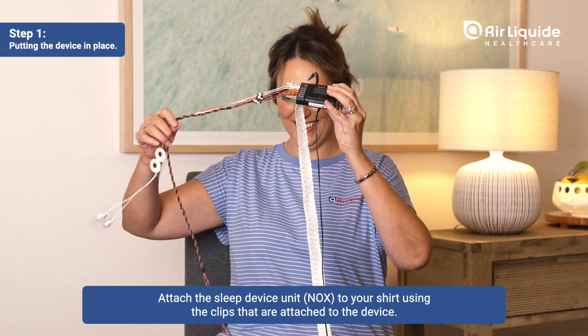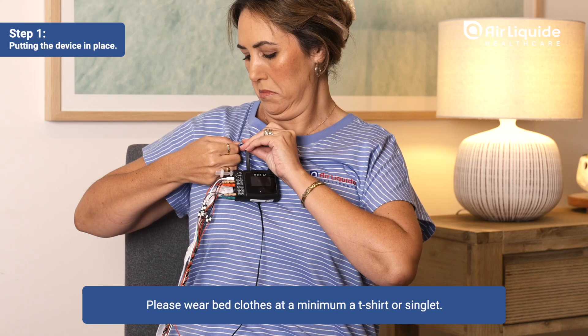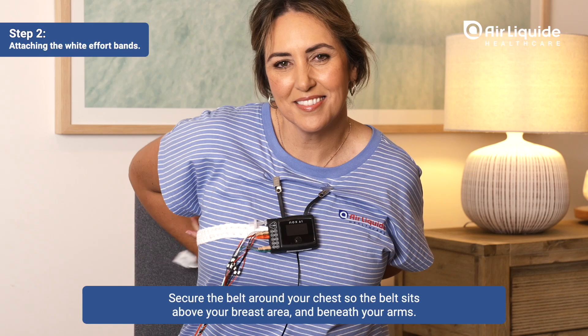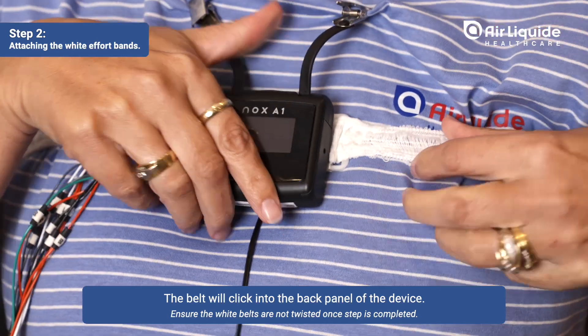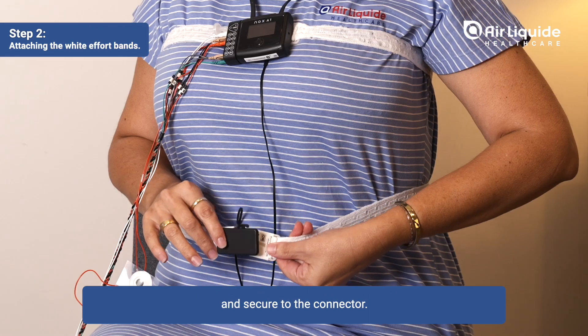Attach the sleep device unit to your shirt using the clips that are attached to the device. Please wear bed clothes, at a minimum a t-shirt or singlet. Secure the belt around your chest so the belt sits above your breast area and beneath your arms. The belt will click into the back panel of the device. Wrap the second white belt around your waist positioned close to your belly button and secure to the connector.